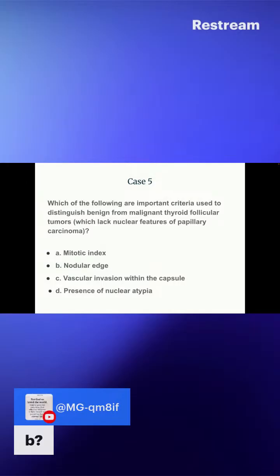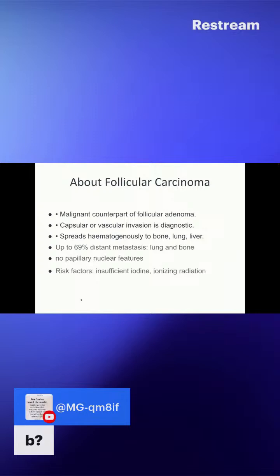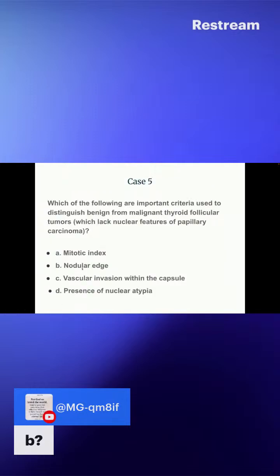B, which is the nodular edge. I see why this can be confusing, but the answer is, oh, sorry. I think it's the right answer. No, no, no. It's the vascular invasion. Yeah, but I can see why you might go for this one.